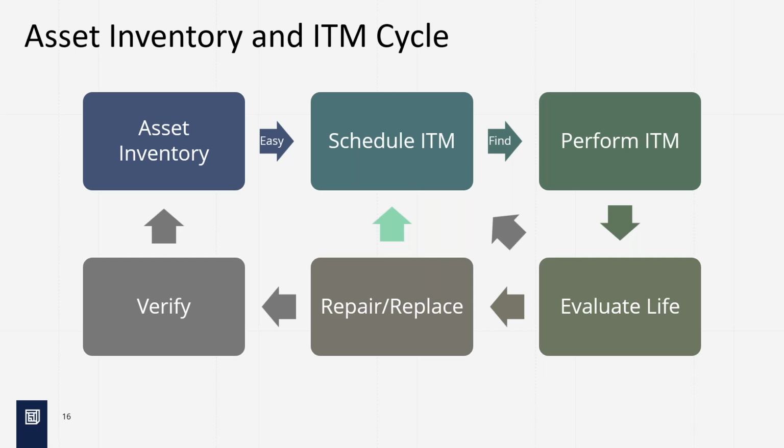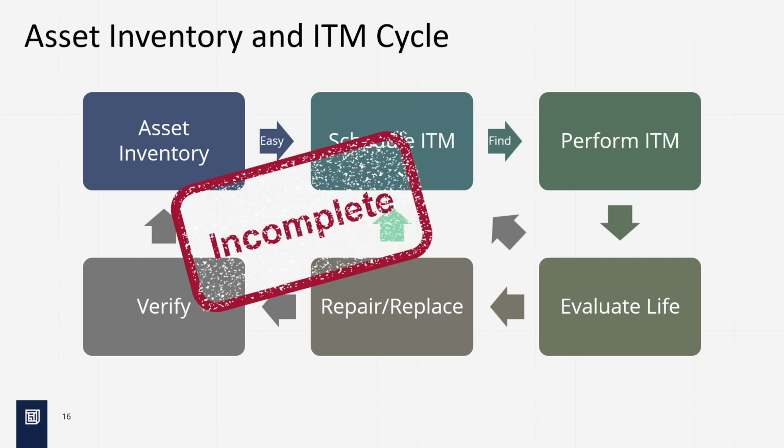When you're initially onboarding it and you're performing that incoming inspection that I'm sure everybody does, what does that need to look like, to make sure that we capture all the critical information about your device inventory? And there needs to be some sort of technological support for each one of those policies and procedures within the tool they use day in and day out.